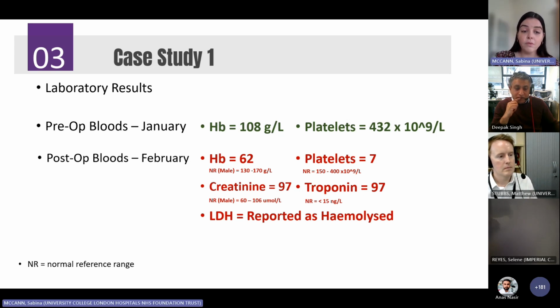So, given these results, what action would you take in response? Confirm sample ID, clot check sample and rerun, inform requesting clinician and suggest repeat, make and review an urgent blood film, refer the blood film to the haematology SPR, action all of the above in an urgent manner, or if you're unsure again, please just select the answer.